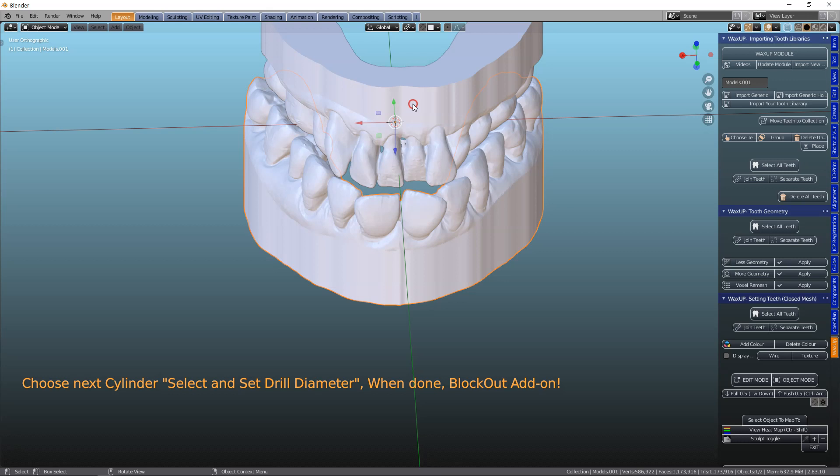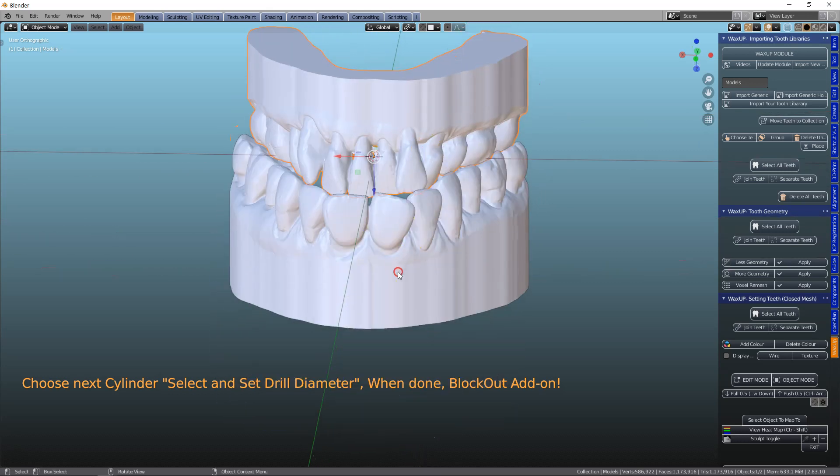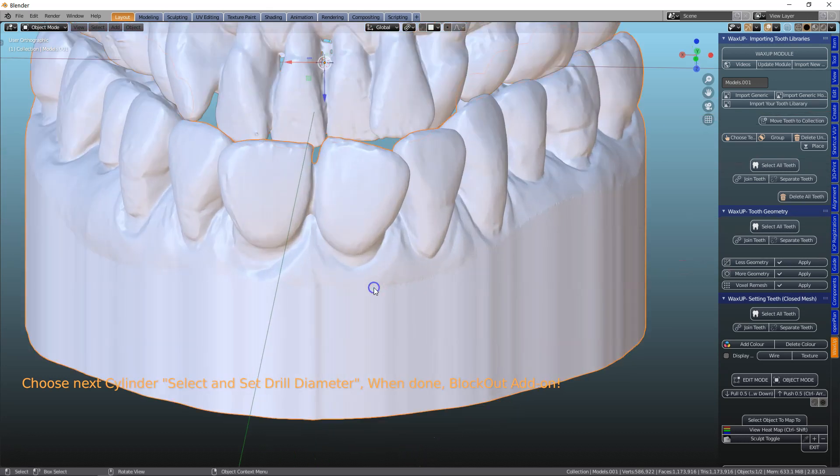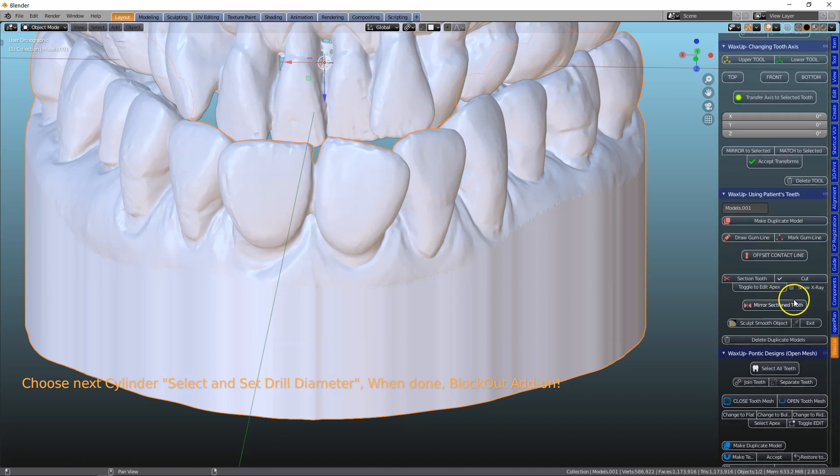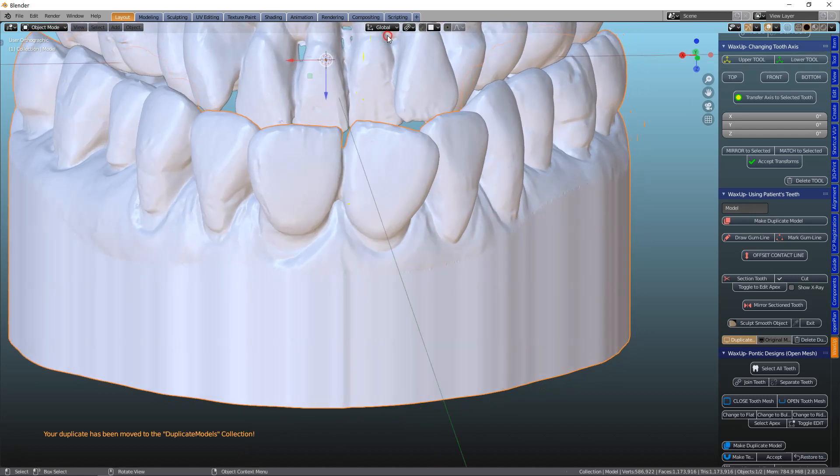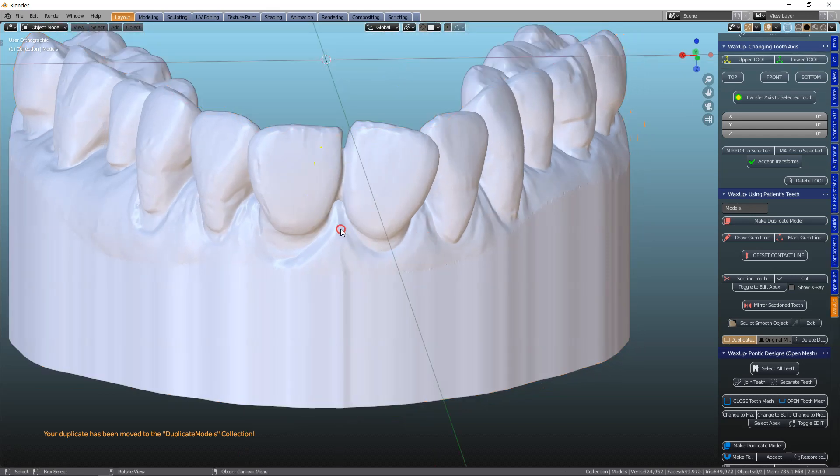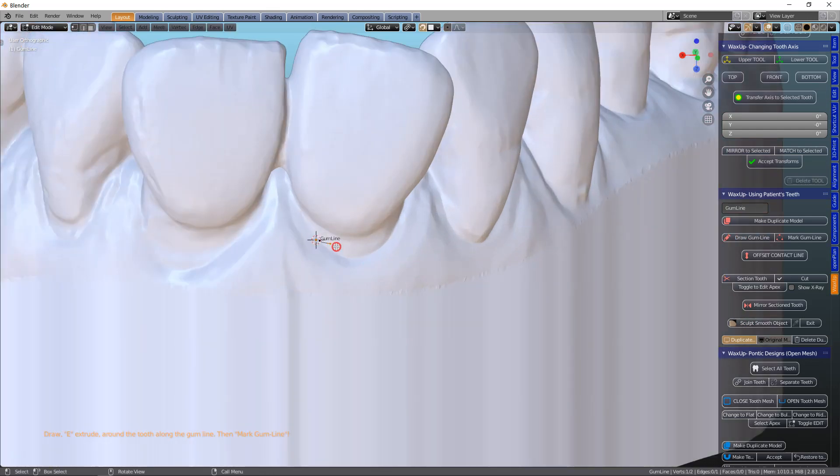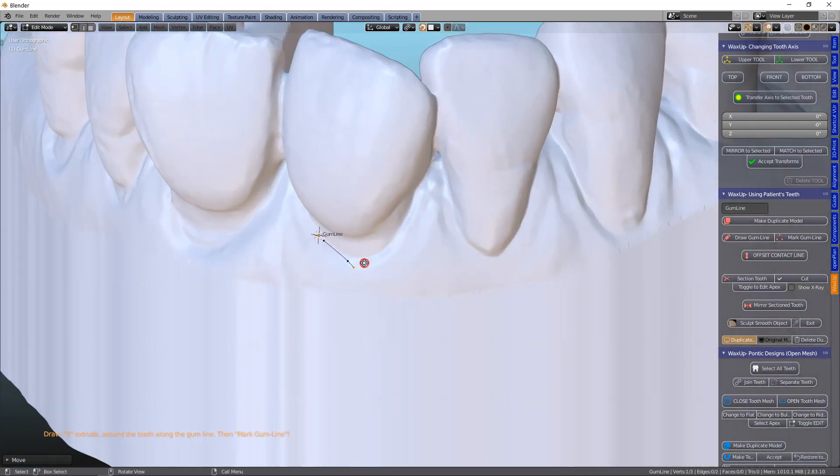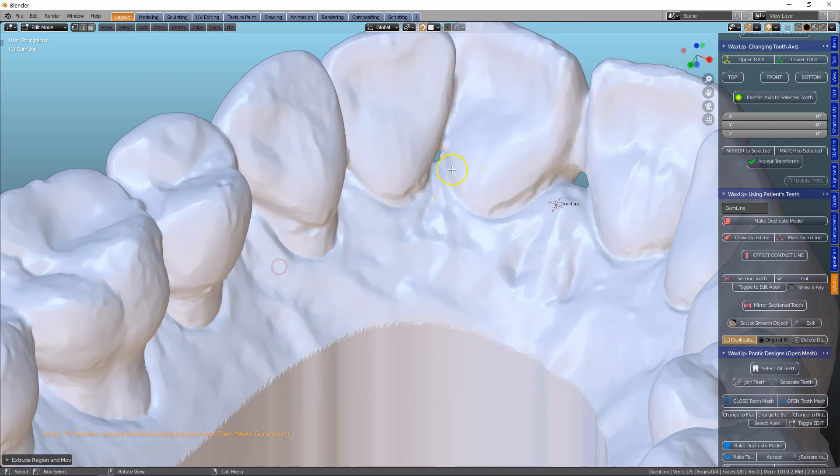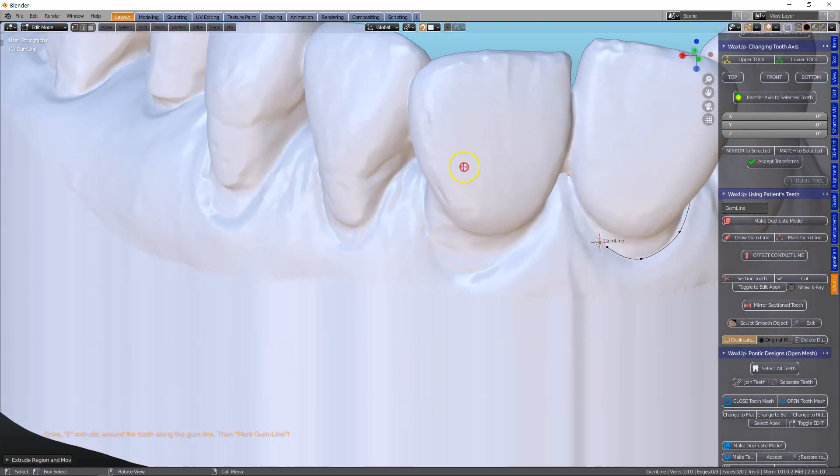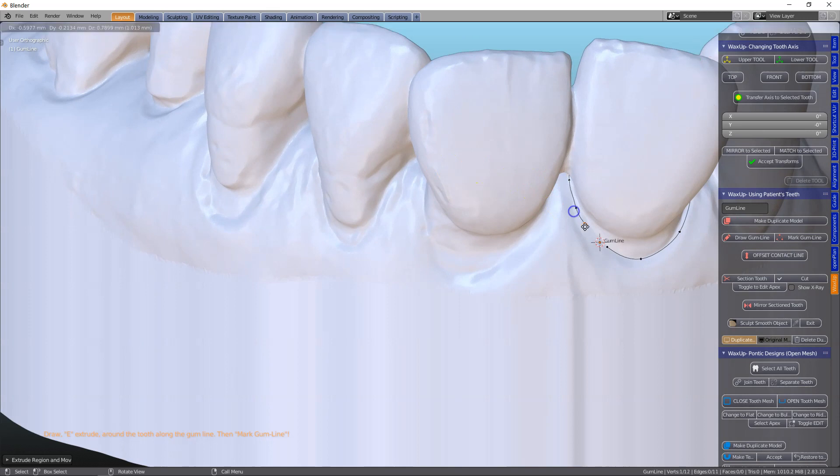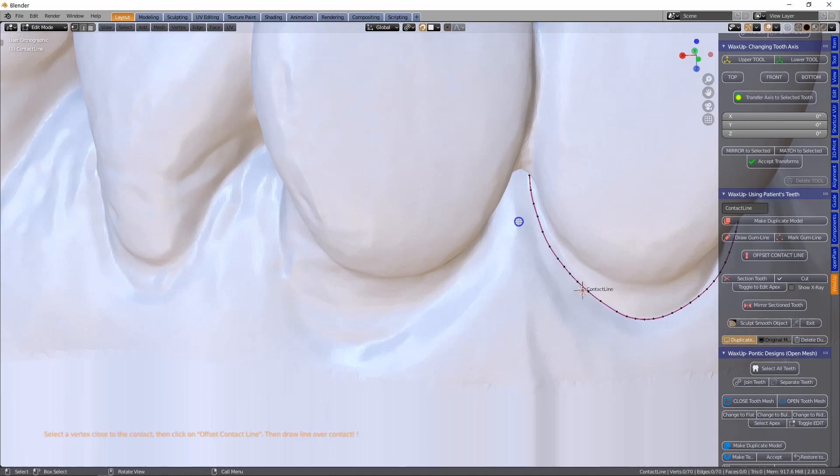So in the wax up module, we're going to select this model and cut off the tooth. The first thing we're going to make a duplicate model and then this one I can hide and we're going to draw the gum line. And then using the E key to extrude all the way around the tissue line, and then joining it up, marking the gum line and then doing the contact.